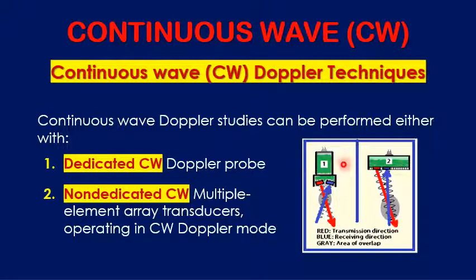But we also need to know that we have array transducers, like the curvilinear, the linear, or the phased array.